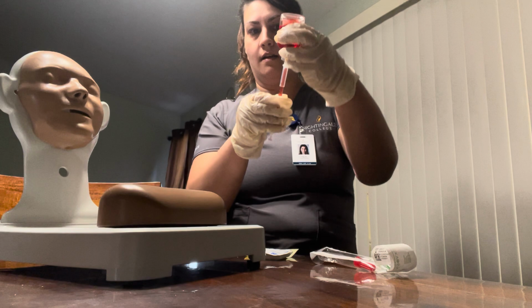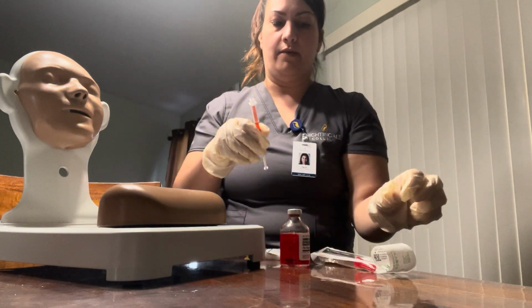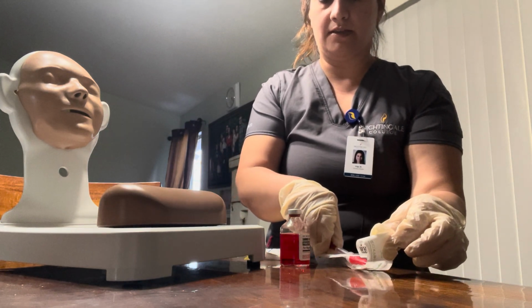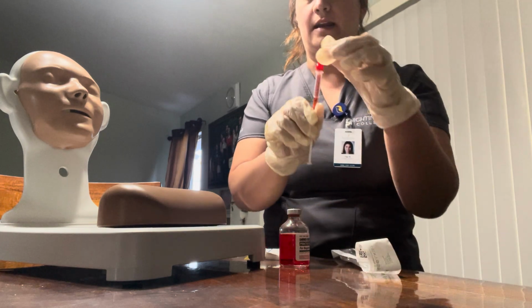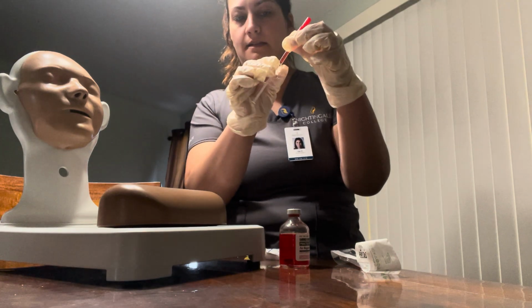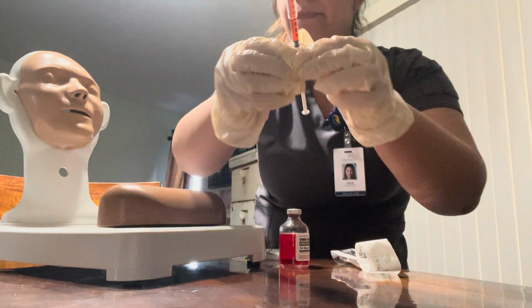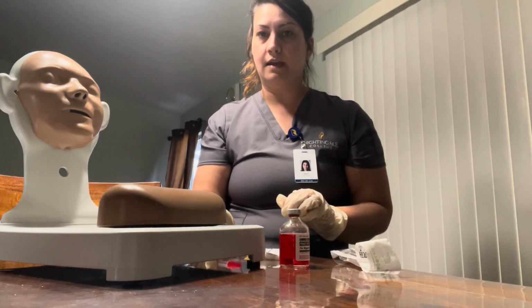I will pull out. I will cap with the one-scoop method, and I will close it. And then I'm going to show you guys, it is 1 mL. Here we go. All right, so I'm just going to set this down.